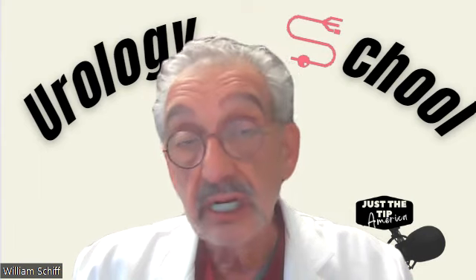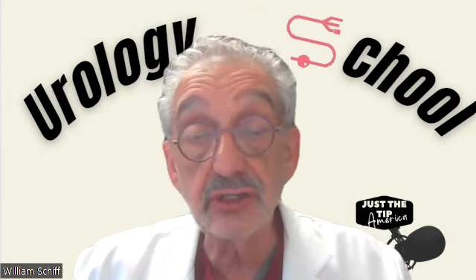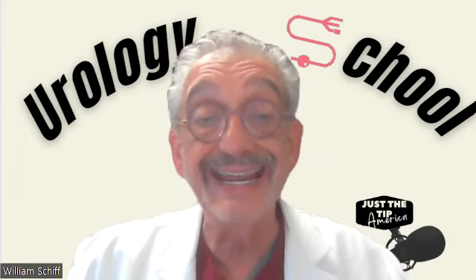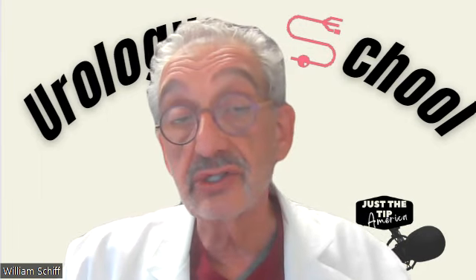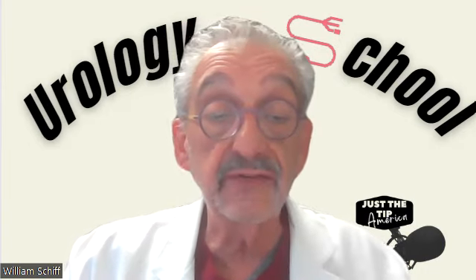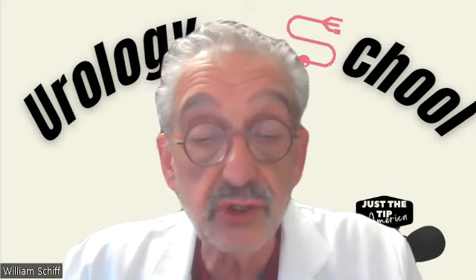Bladder cancer: in staging and identification of wall penetration or muscle penetration and intravesical extension, as well as extravesical extension and lymph node disease. It's a great modality for this as well.